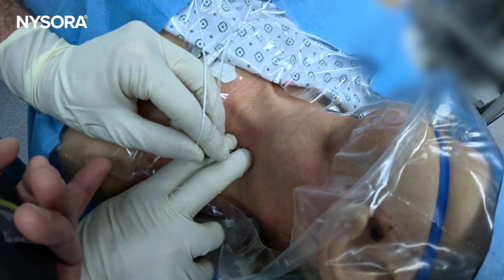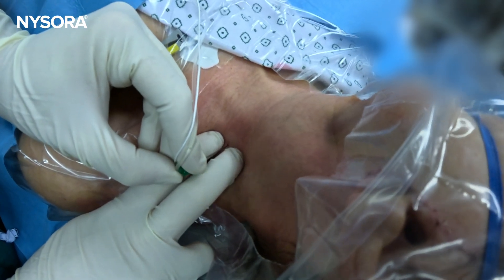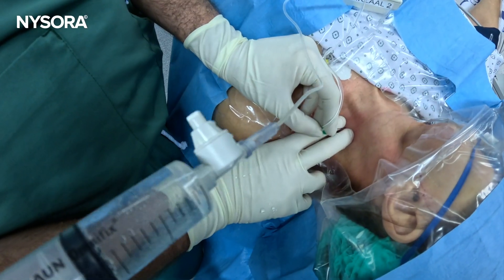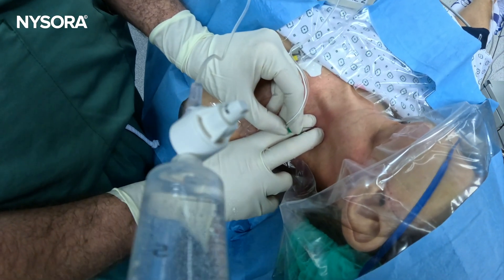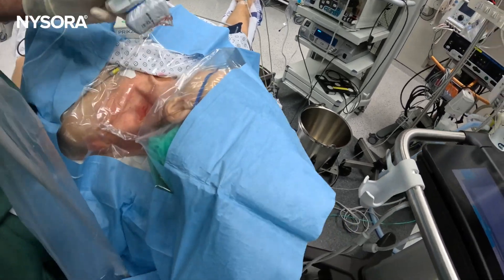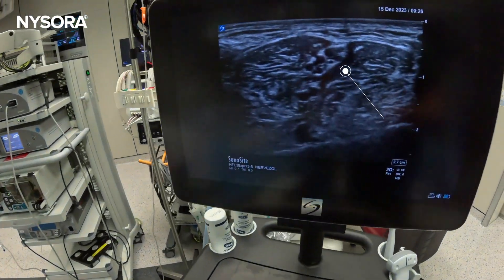Pull back, then go slightly posterior. There you go. Aspiration negative, and injection goes in. Take it out, and bring in the ultrasound now. Let's see what we've done. That's your local anesthetic spread.